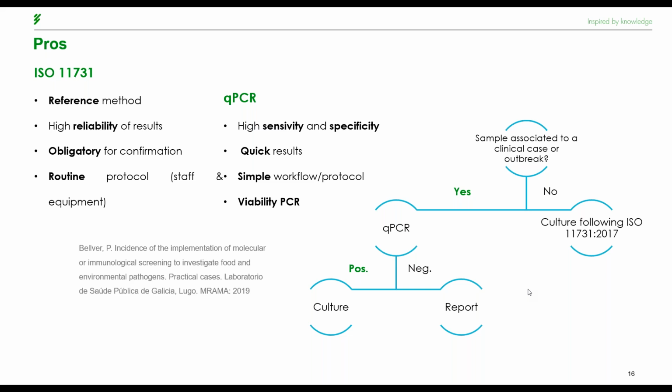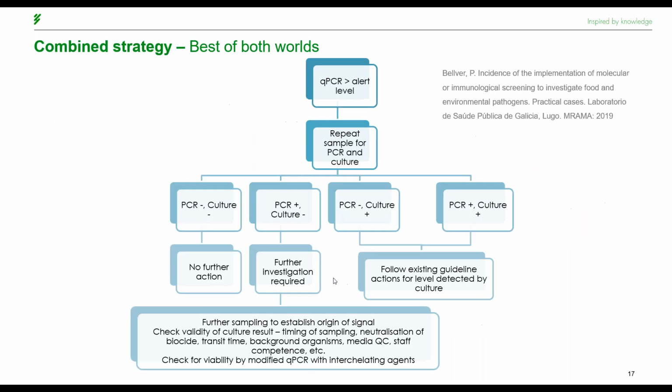If the result you obtain is negative, okay, there is nothing more to do. However, if you have a positive PCR, a confirmation culture must be performed, but the days to give a result have been reduced considerably.